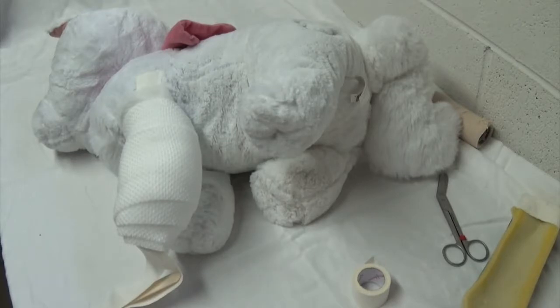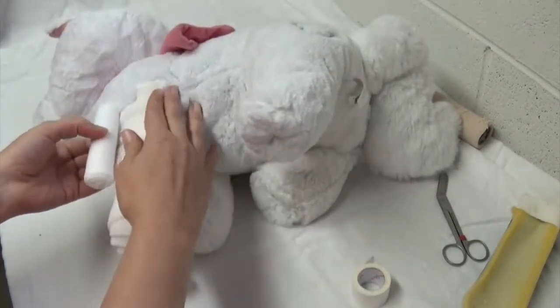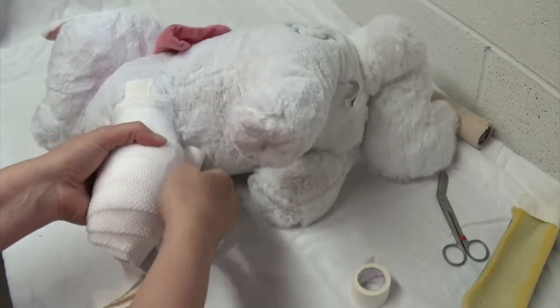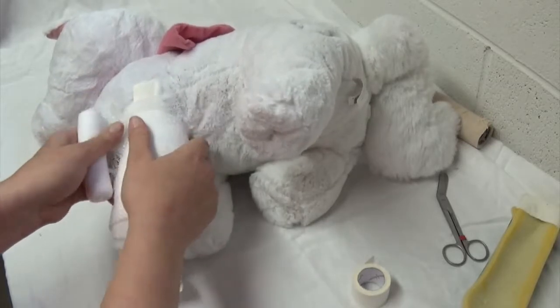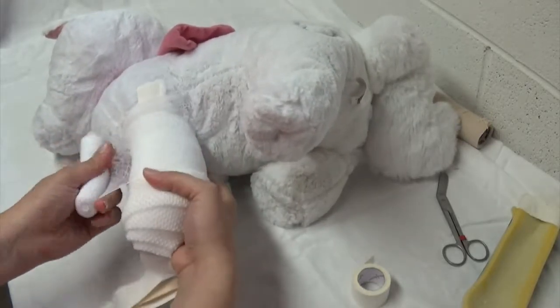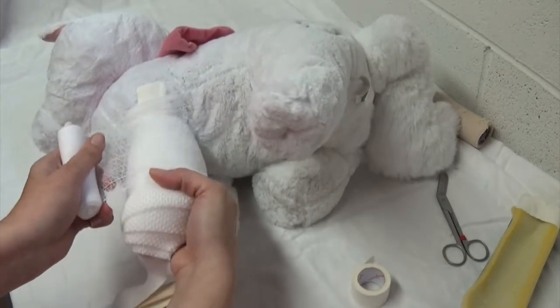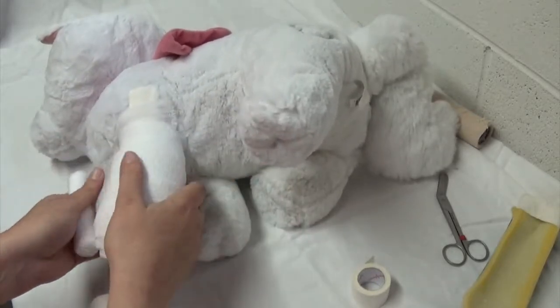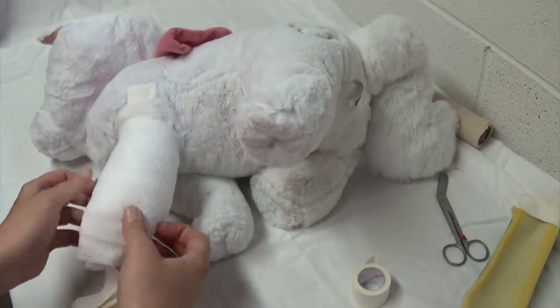The next part of the secondary layer is our cling, our stretch gauze. Start at one aspect of the limb and begin adding a little bit of pressure, because we do want to compress the fracture and not allow it to move. Don't pull the stretch material to 100% tension — you just want it snug, with every pass pulling just a little bit more, going all the way down to the end.